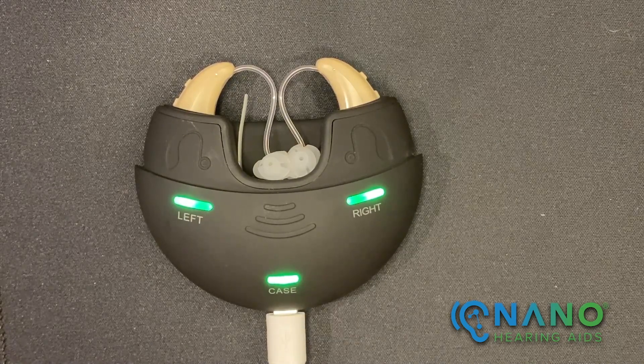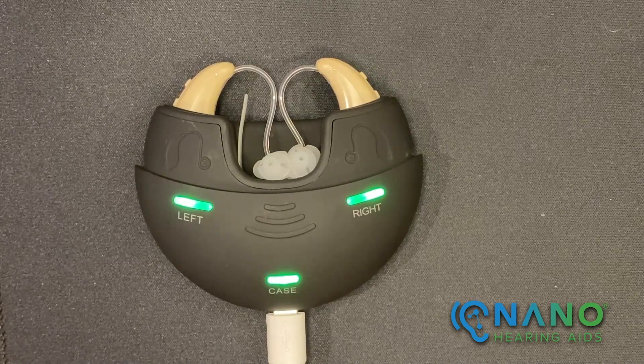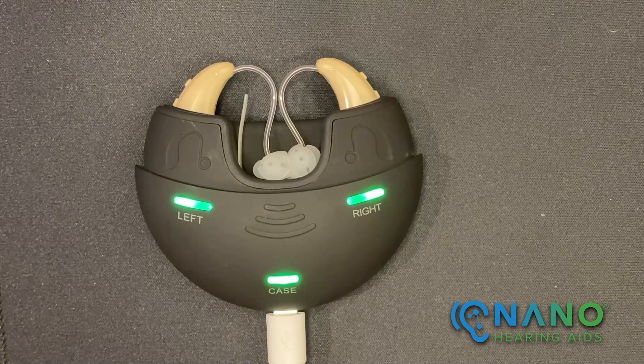Orange lights indicate the charging case or the hearing aids are charging. Green lights indicate the charging case or the hearing aids are fully charged.